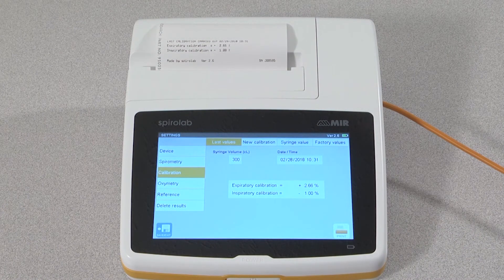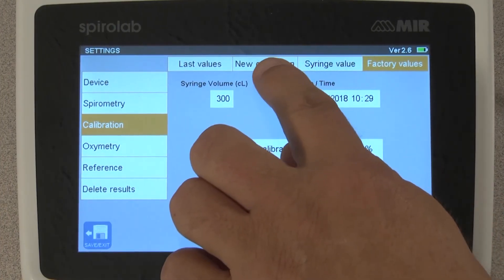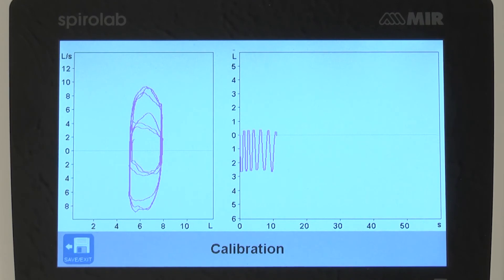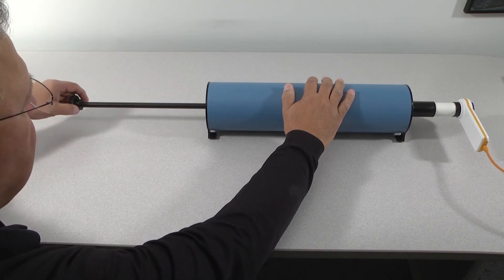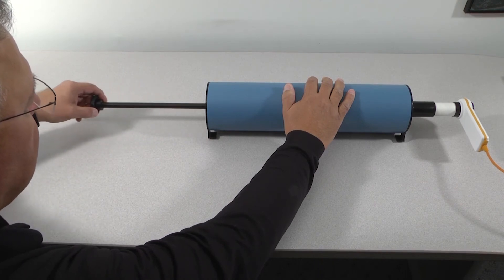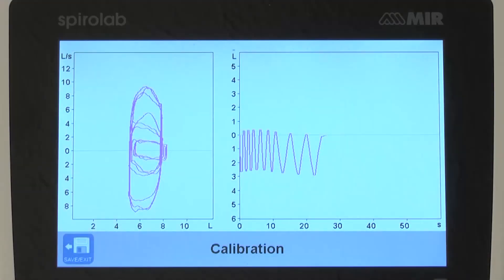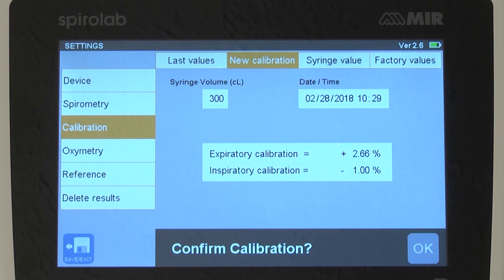If the results are outside the plus or minus 3% range, repeat the test for a second time by restoring factory values and doing a new calibration. Always check to be sure that you have a tight seal and that no air is leaking at the syringe and the turbine. If the results are still outside of the 3% range again, redo the test for a third time, checking for a tight seal and no air leaks, and be sure to pull and push the syringe piston all the way to the built-in stops in each direction. If you do not get a passing range of plus or minus 3%, contact MIR customer support. Initially, you may experience results that are out of range, but as you repeat the procedure, you will become more consistent with the speeds at which you are pushing the plunger and your results will become more accurate.